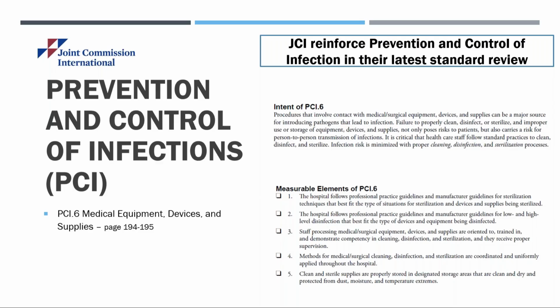So the Joint Commission prevention and control of infections guideline says: procedures that involve contact of medical surgical equipment, devices, and supplies can introduce pathogens and lead to infection. They note failure to properly clean, disinfect, or sterilize and store the devices not only poses a risk to the patient, but carries a risk of person-to-person transmission. And it's crucial that healthcare personnel follow standard practices for disinfection and sterilization, which include proper cleaning and then appropriate disinfection and sterilization per the Spaulding classification.